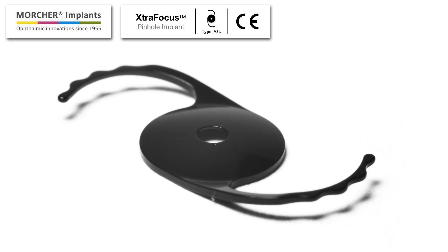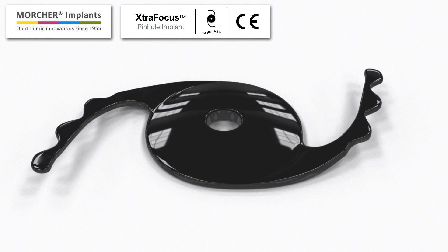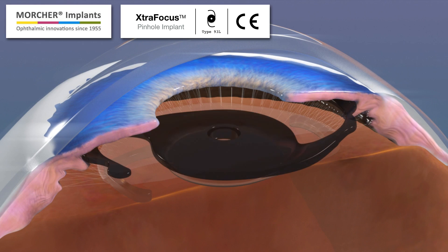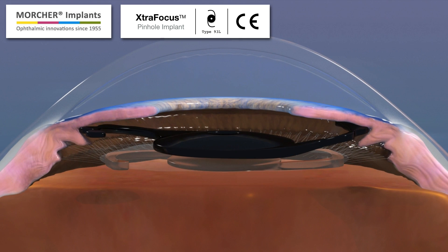This is the design of the XtraFocus pinhole implant manufactured by Morcher. It is made of a foldable black hydrophobic acrylic and is intended for sulcus implantation in pseudophakic eyes in a piggyback configuration.